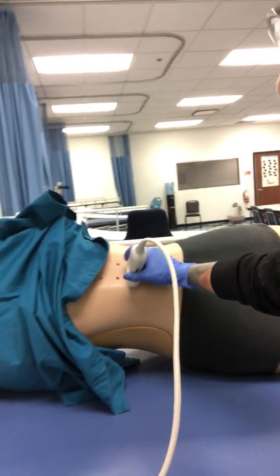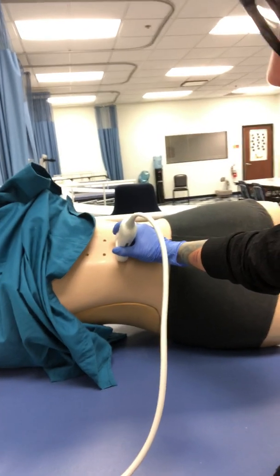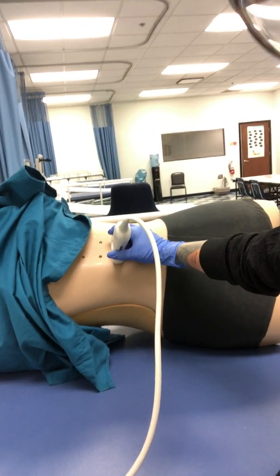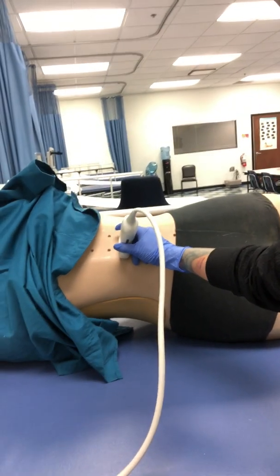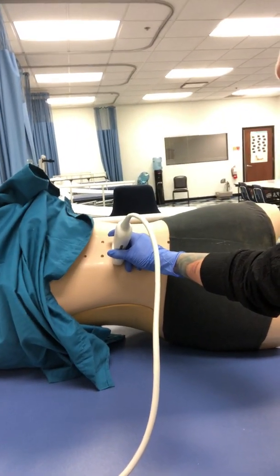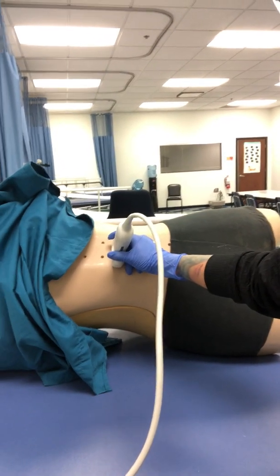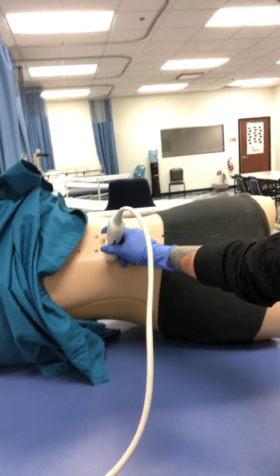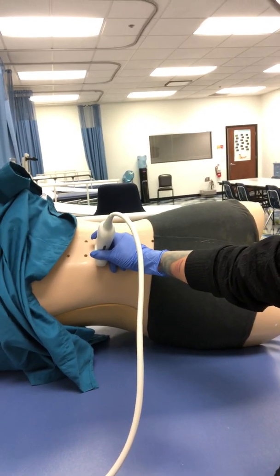If we're sitting, I'm directly on the spine. We don't typically scan that on an adult. But if we look at where I'm scanning from and to, my notch is now currently pointing towards the patient's left-hand side, whereas if they were in the supine position, it would be pointing towards the right, but we have it towards the left-hand side. And this is why it's important to annotate your pictures, that you do have the patient in the prone position, because if not, everything might look a little bit backwards.